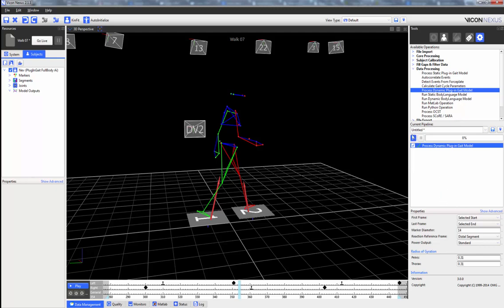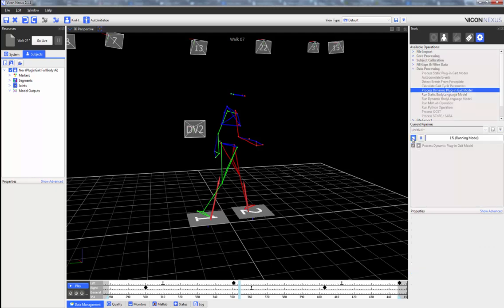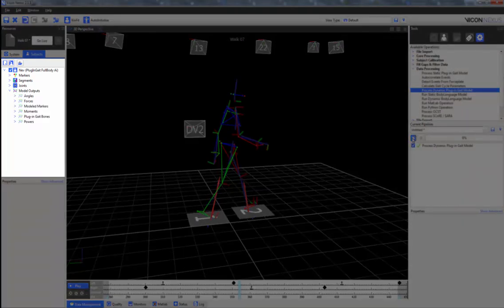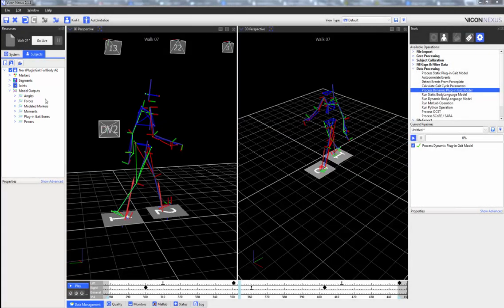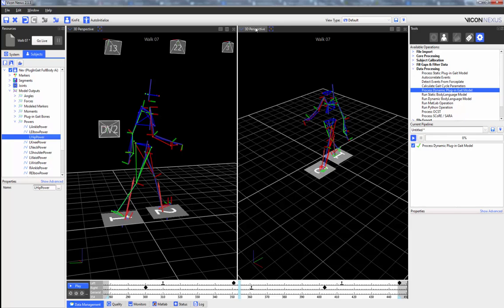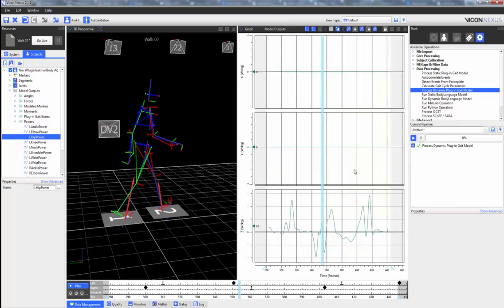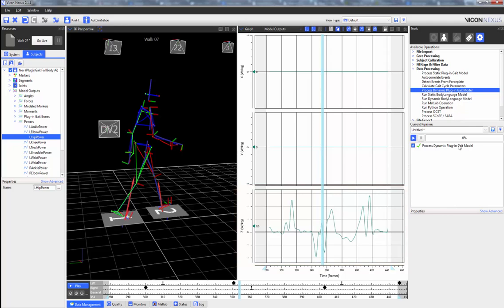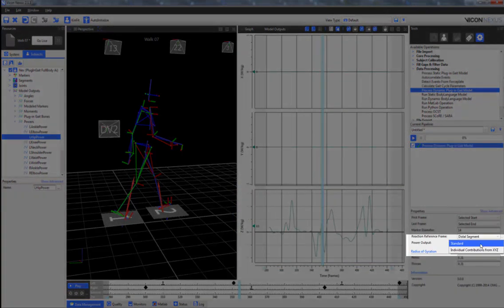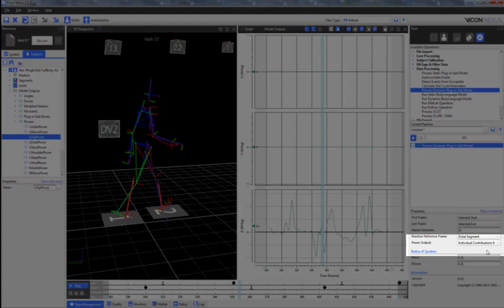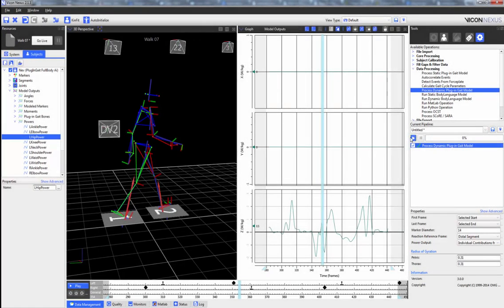Once the model has been run, we can see that the model outputs have been populated. By default, the power is calculated as a scalar value. However, we can also adjust the power output so that it exports the individual contributions from the X, Y, and Z components, as we can see here.